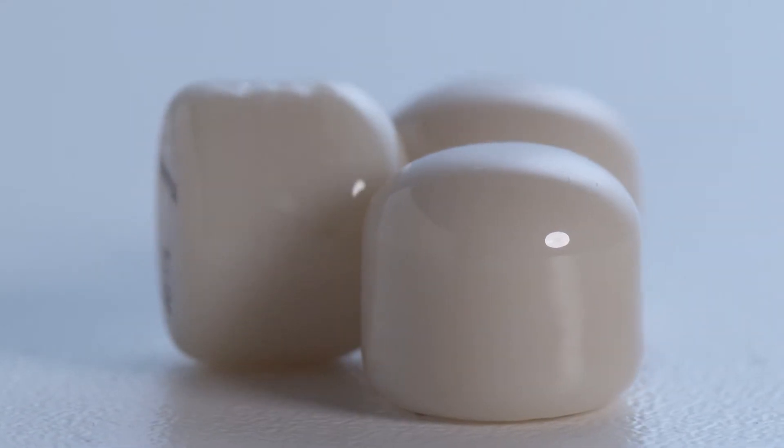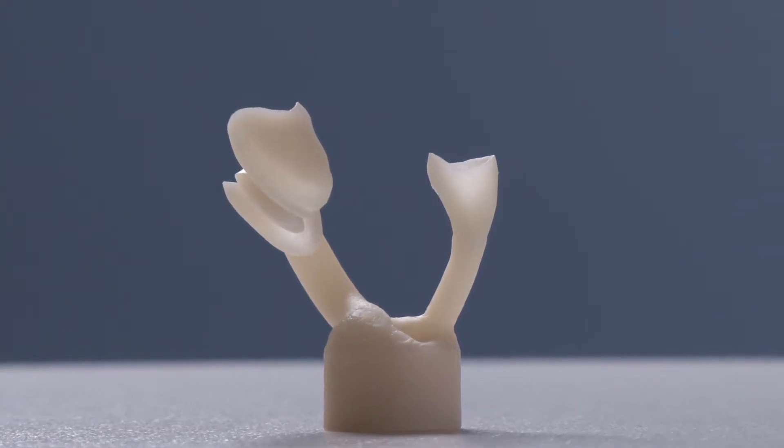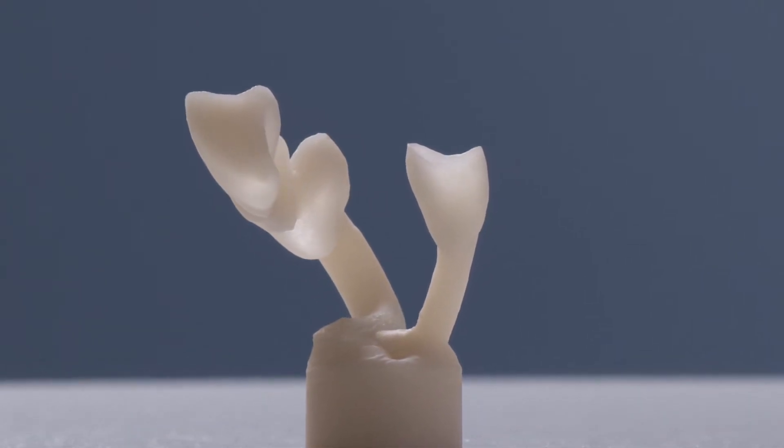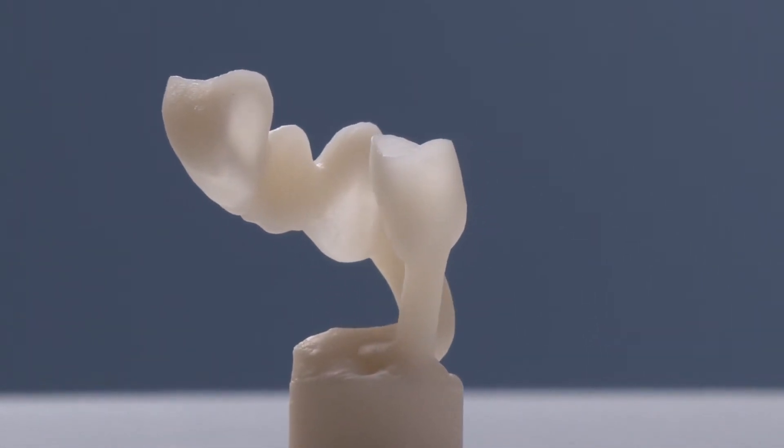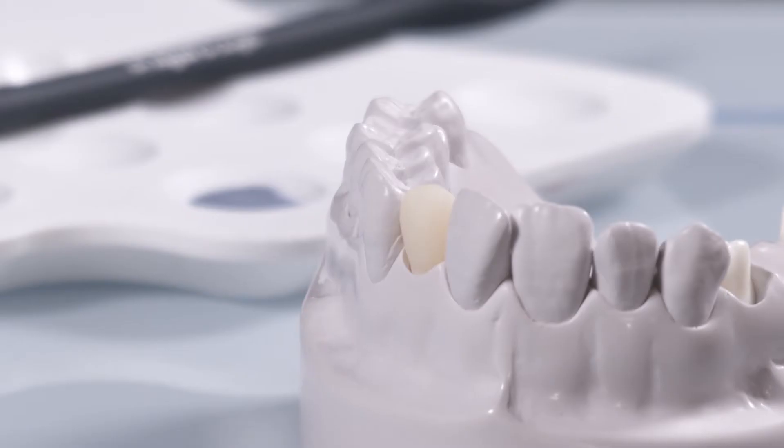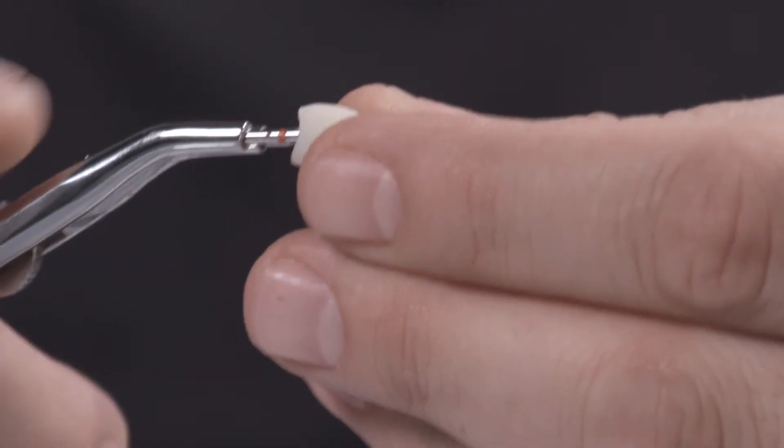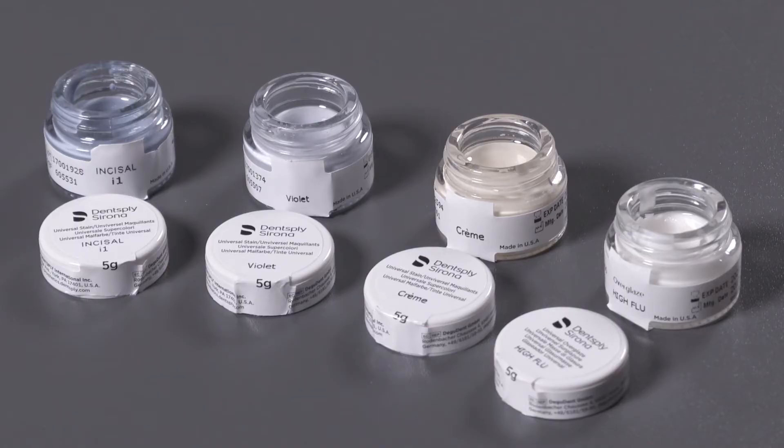Due to the exceptional light optical properties of Seltra Press, you can achieve excellent aesthetics quality already in a monolithic restoration. Customization with only three universal stains and the final glaze can be carried out quickly and accurately.